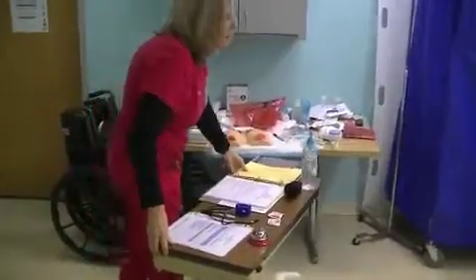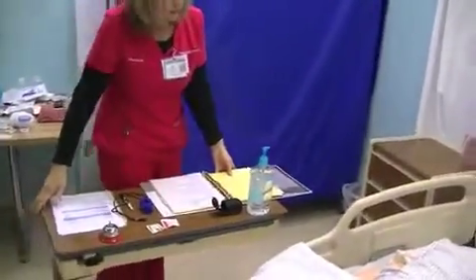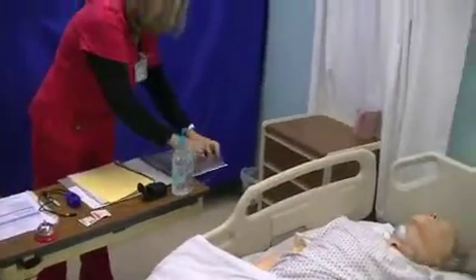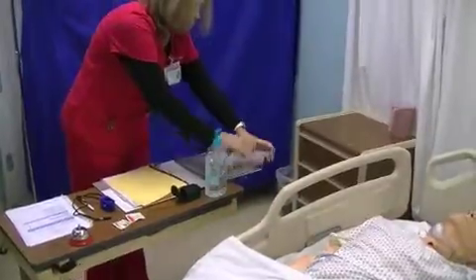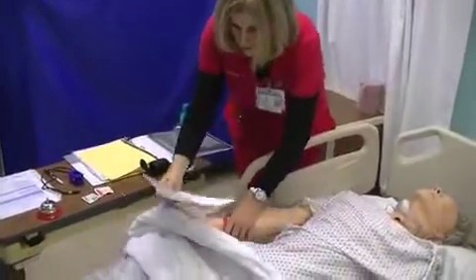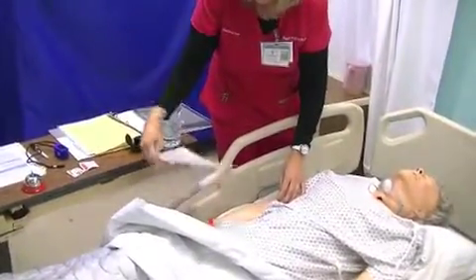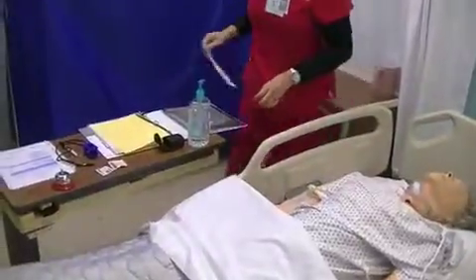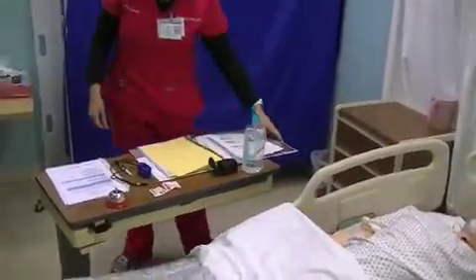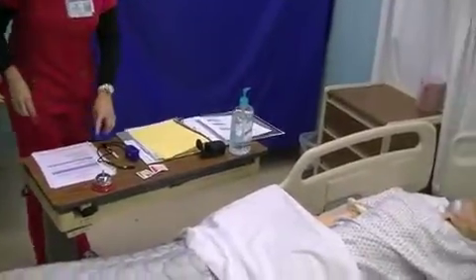Hi, good afternoon. My name is Mrs. Kyle, and I'll be your nurse today. Can you please give me your name and date of birth? Okay. Mr. Pierce. Matching the armband with the patient, and date of birth 10/3/1960. Okay, Mr. Pierce, I'm here to take your oxygen saturation, and that's to see how much percent of oxygen is in your blood.